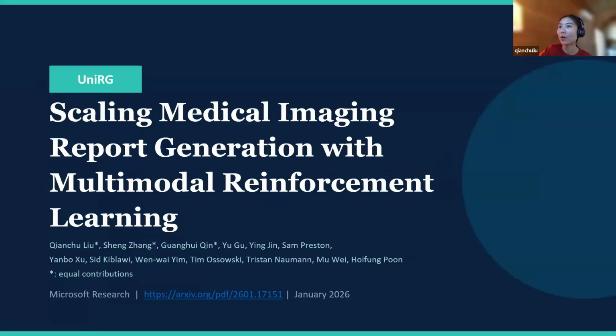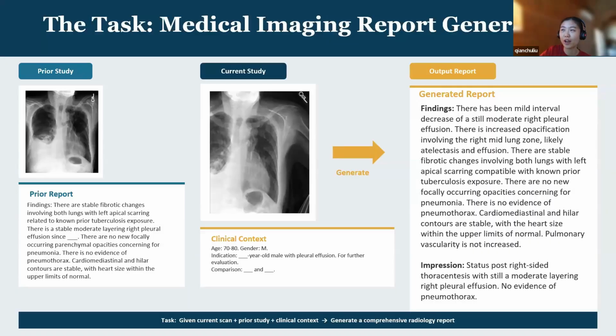Okay, I will start with introducing the task. I'm sure many of you are probably very familiar with the task, but just a very quick recap. In this study, we're looking at medical image report generation, and specifically, we're looking at chest X-ray report generation. And the clinical workflow is like the following.